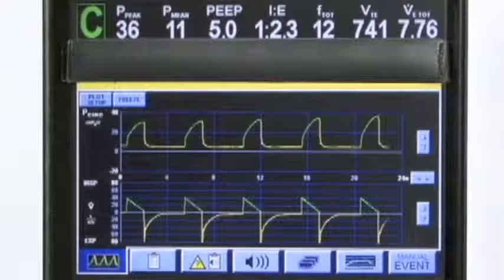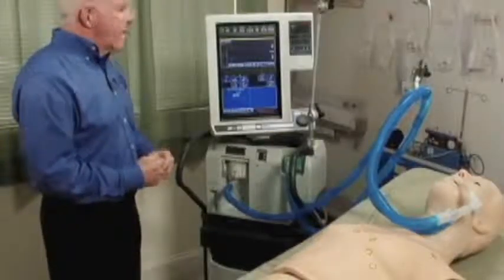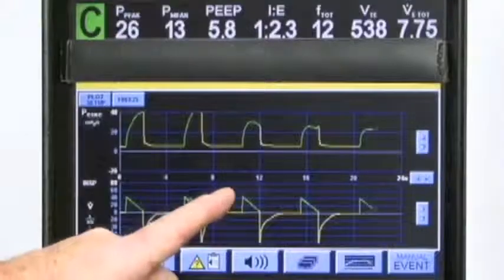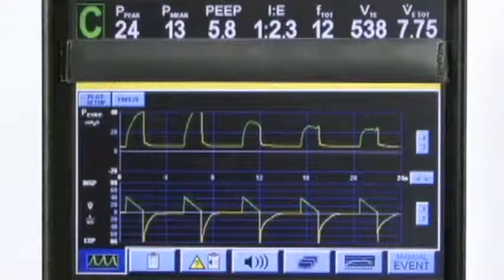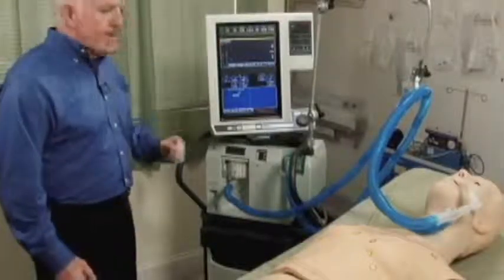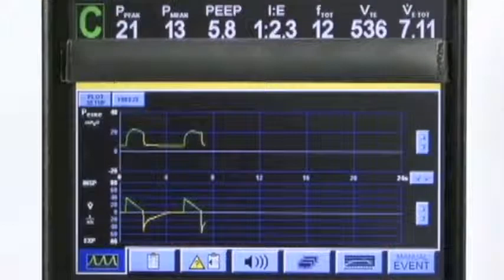Now, if we make the lung looser or increase the numeric compliance value, once again, while the mannequin is fully operational, maintaining complete realism while HAL is ventilating above his set peak level. We see a return to lower peak pressures and very realistic respiratory graphics.